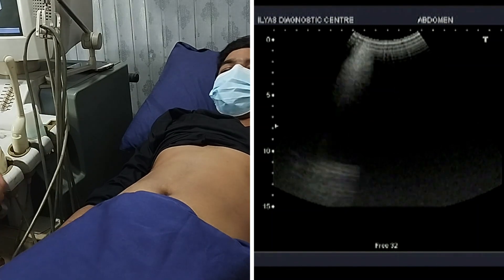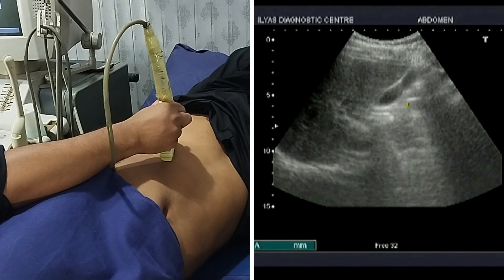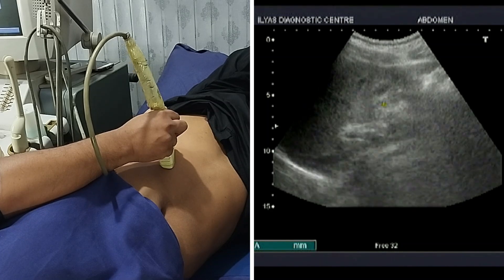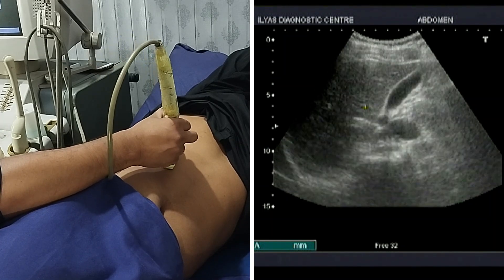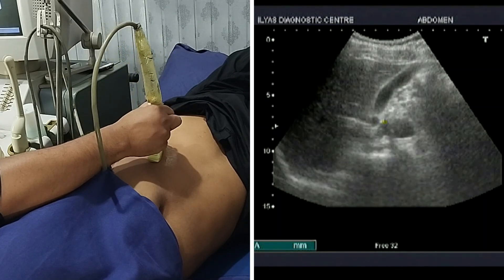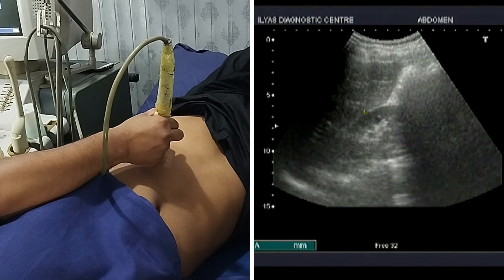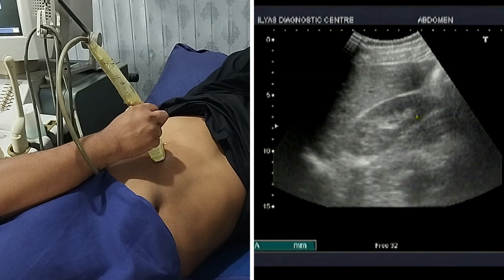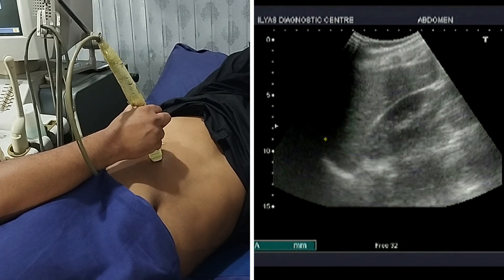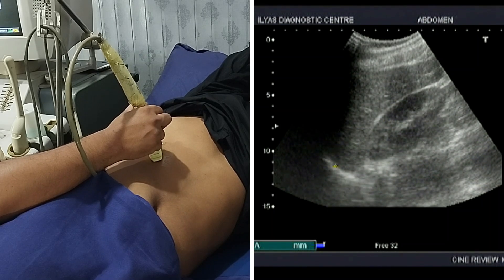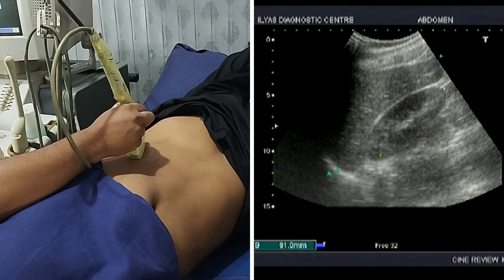Now I will ask my patient to turn toward the left side and I will put my probe here. Turning the patient in the opposite direction is very important because most of the time the stones in the gallbladder will be visible in the neck region — the stones will be visible on taking the lateral position. Here you can see that I'm not moving my probe very much, I am just tilting it. Tilting in one direction shows the kidney and in the other direction shows the gallbladder, and the liver is visible all the time. I will freeze the image and take measurements.